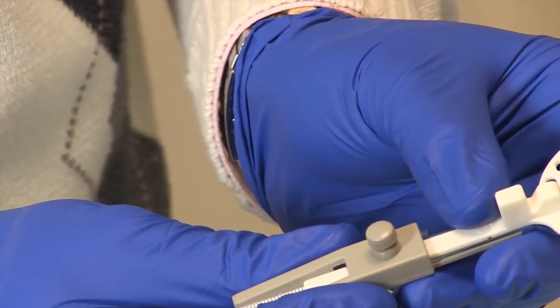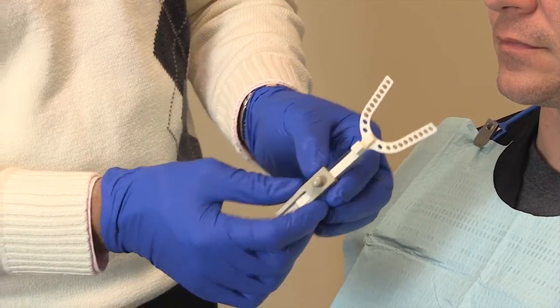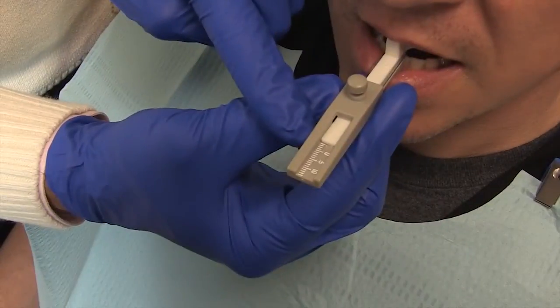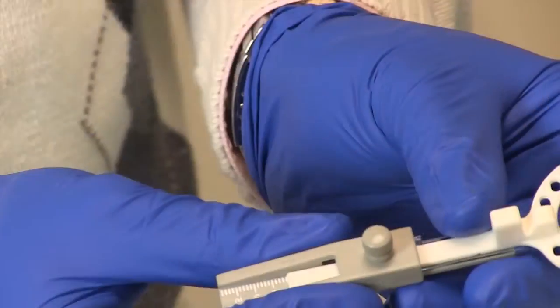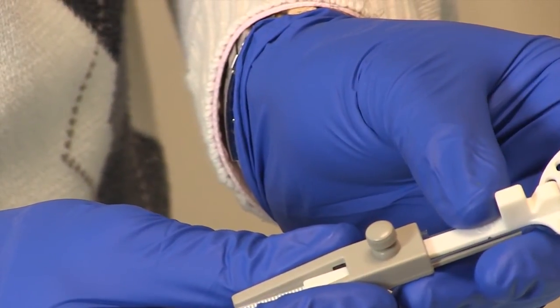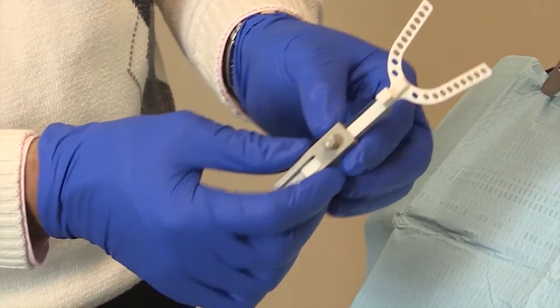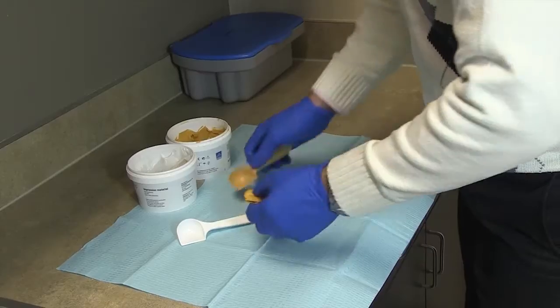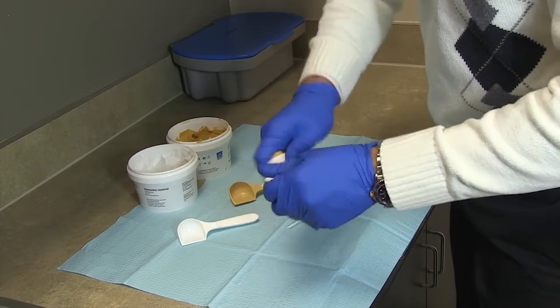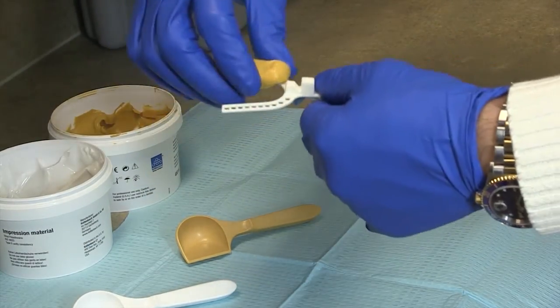Now calculate 60% of the maximum range. Remember to account for the entire range of motion. Don't just subtract the two numbers. Notice on the George gauge it has a positive and negative portion. Multiply the entire range of motion by 0.6 and set the George gauge at 60% by tightening the knob on the upper arch.